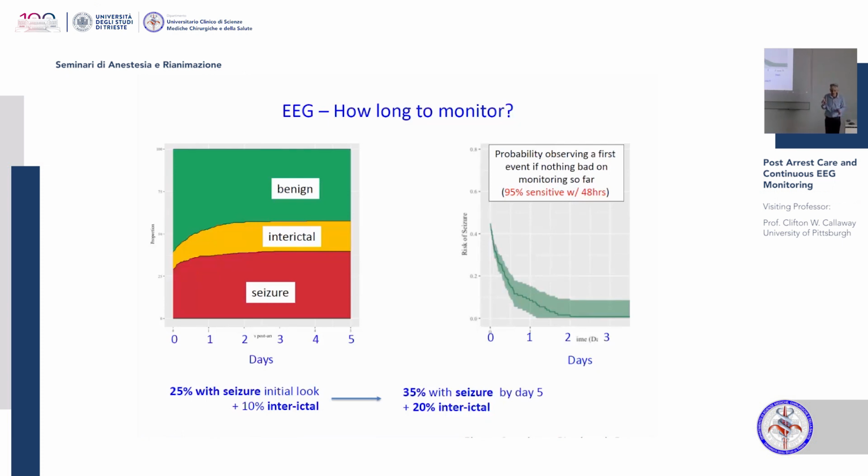It's different if something bad has happened. If you're seeing epileptic discharges, well, this is the pathology we're looking for, and now you have to decide to treat them. Those people may be on monitor, like my patient I just showed you, for 2 weeks while you're titrating lots of medicines. And maybe after 2 weeks, you know what's going on, and you can take the EEG off and just come back and check it every day or every other day and reduce your usage.